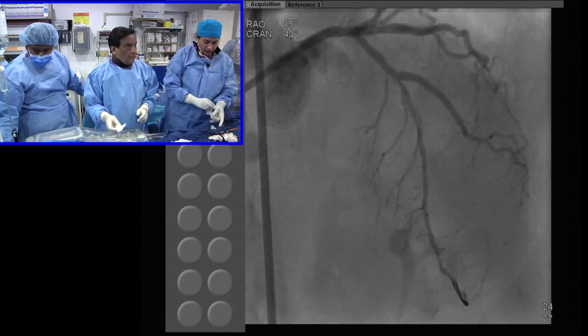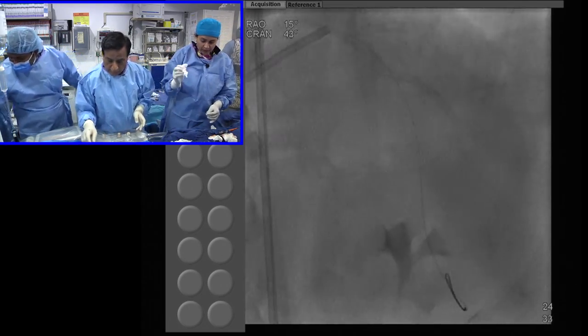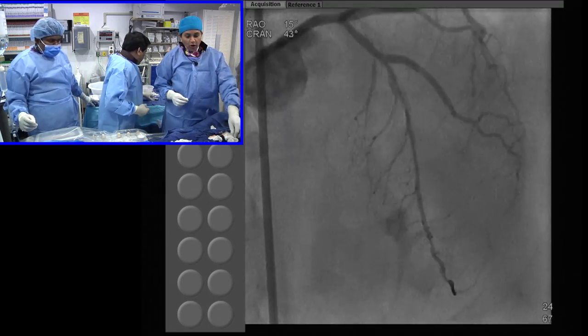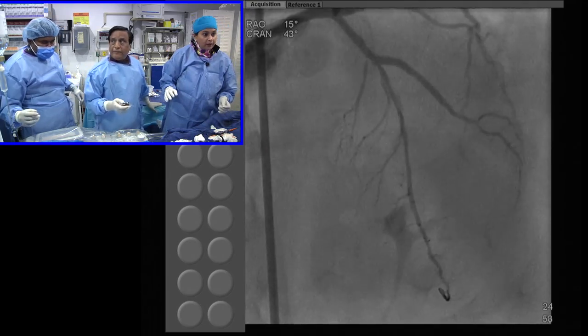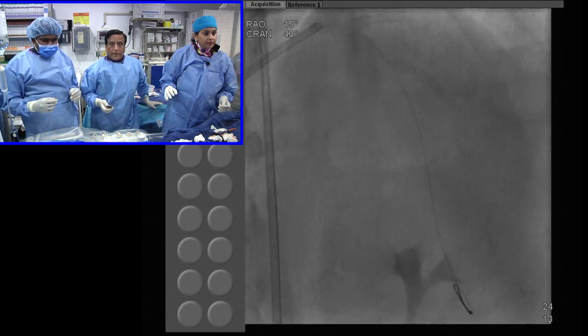Good. Okay, let's get a 3028. That's what I have been telling from the beginning. So with that, my goal is to decrease the overlap, to have minimal overlap. Yes. So with that, if we can come to the slide very quickly, I can talk about one more point which we had.